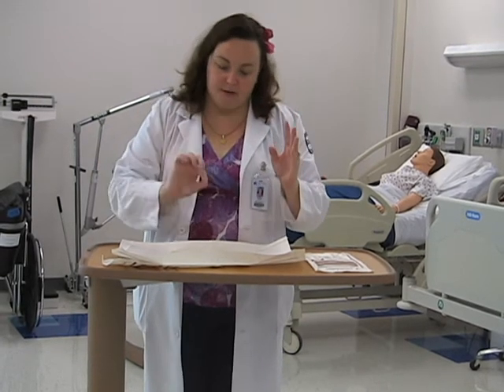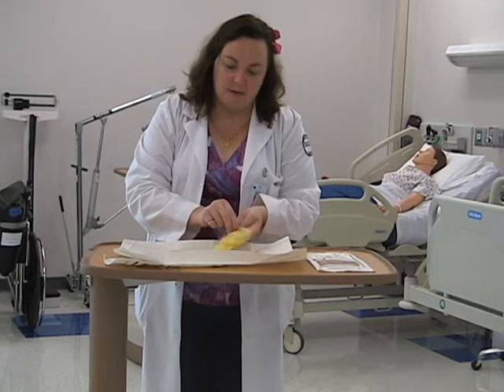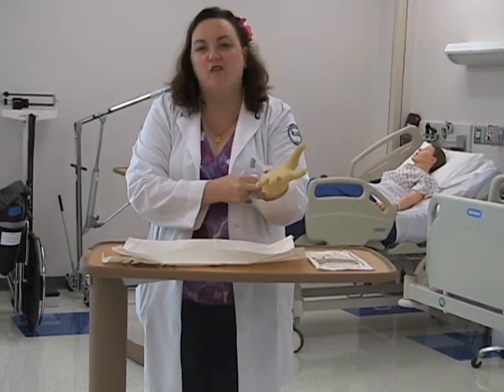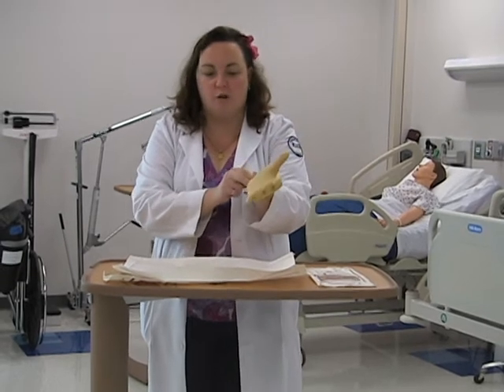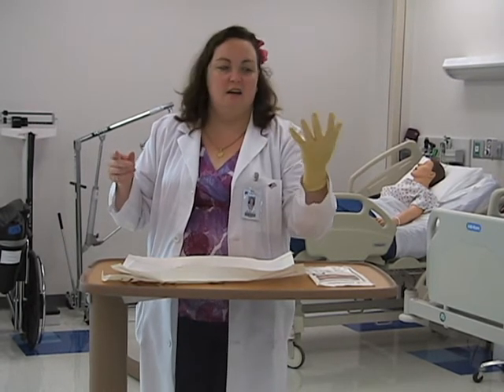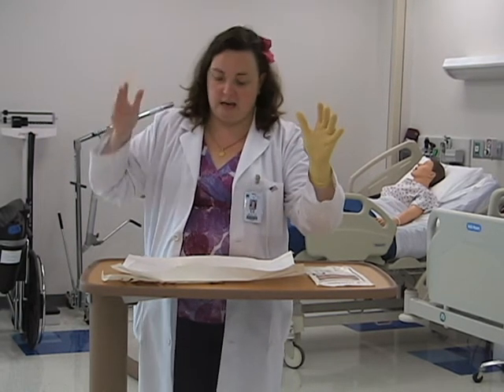Using your non-dominant hand, you're going to grab inside the cuff and put your dominant hand in first. Don't be alarmed if your fingers don't go in all the way or if they bunch up in one finger. As long as you have that glove on, we can fix the fingers and adjust the seating of the glove once both hands are sterile. So this is a sterile hand, and this is your clean hand.